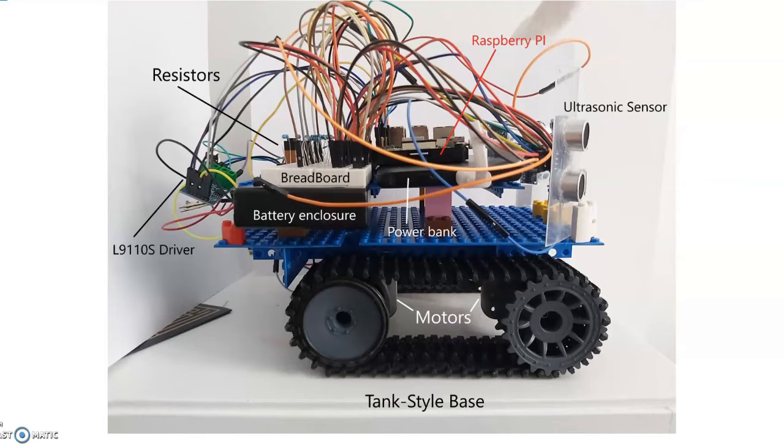Starting from the bottom, to support the weight of the device, a tank-style base was installed which had 2 powerful gear motors attached to it to power the movement. To control both motors separately, an L9110S driver was implemented. This one can be spotted at the back of the device.